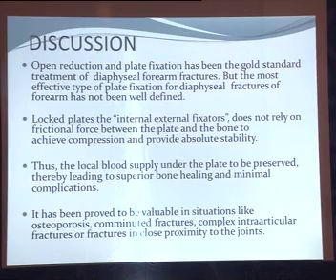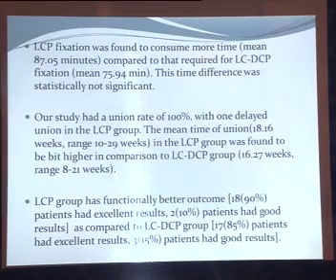Coming to the discussion, open reduction plate fixation has been the gold standard treatment of diaphyseal forearm fractures, but the most effective type of plate fixation for diaphyseal fractures of forearm has not been well defined. Locking plates, the internal external fixators, do not rely on frictional force between the plate and bone to achieve compression, and provide absolute stability. The local blood supply and the periosteum are preserved, thereby leading to superior bone healing and minimal complications. It has been proved to be valuable in situations like osteoporosis, comminuted fractures, complex intra-articular fractures, or fractures in close proximity to the joints.